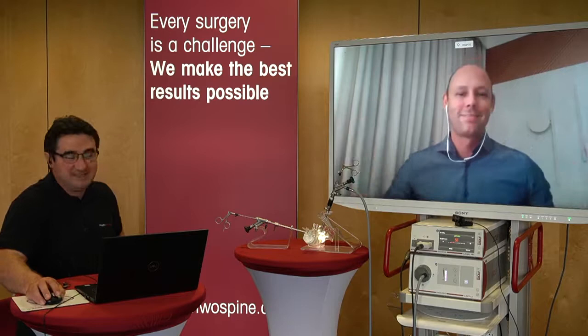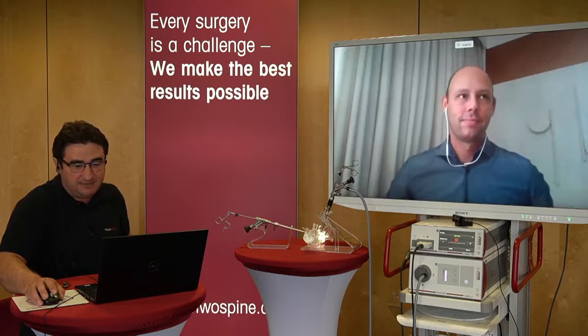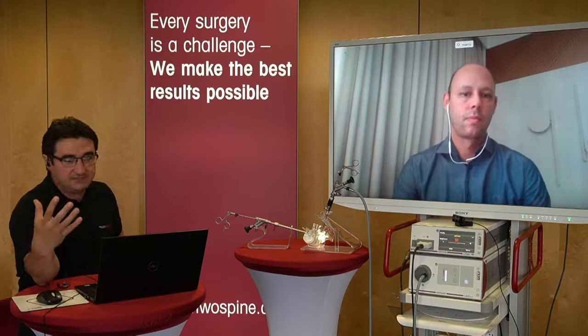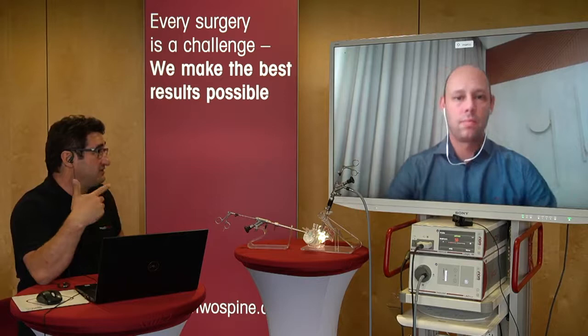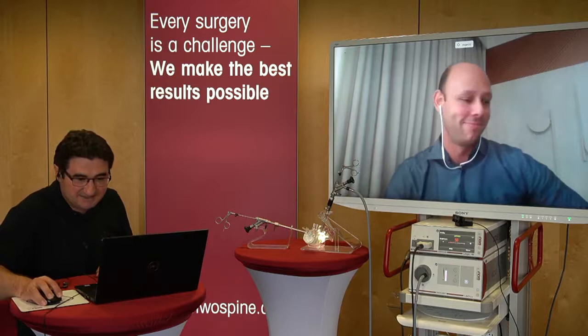It is possible to do posterior cervical with the interlaminar instruments, but you have to have a 2 millimeter rongeur, the scissor, and the smaller burrs for the cervical. Of course, the optimal instruments are the cervical optic and the cervical sleeve, but if you don't have them in your hand, then you can do it with the interlaminar instruments. As you mentioned, please have the 2 millimeter rongeur, the smaller the better, and the smaller scissors. And you need more experience to use the interlaminar approach in the cervical. Yeah. Okay.